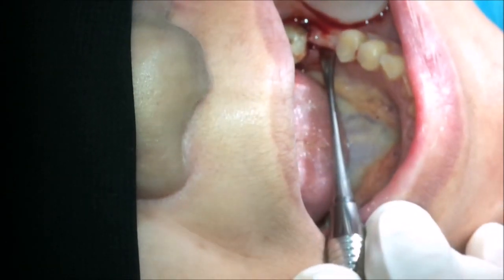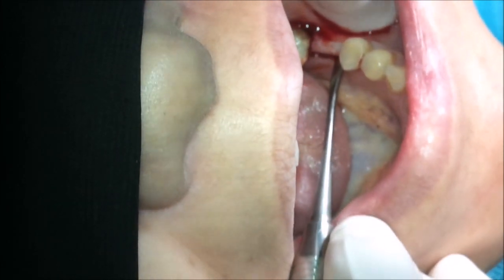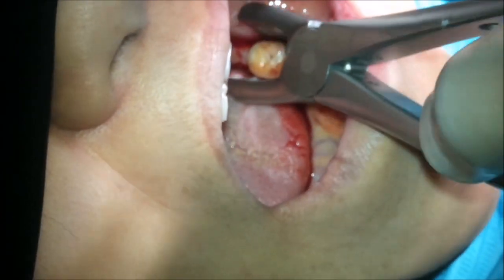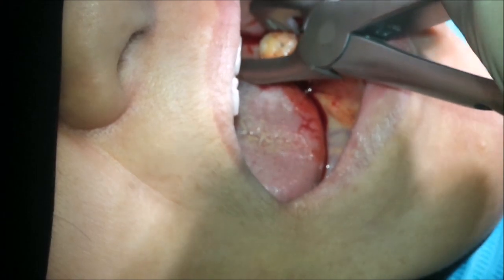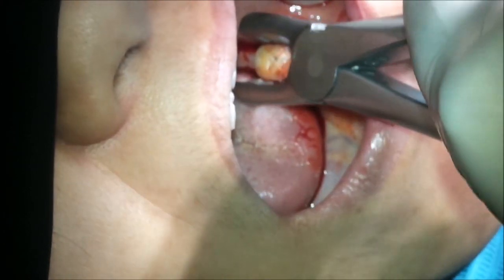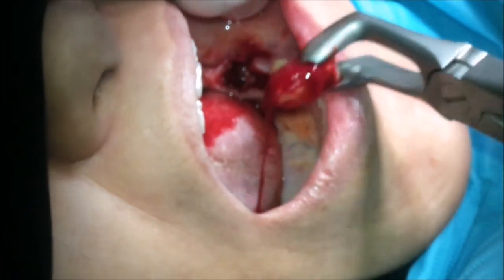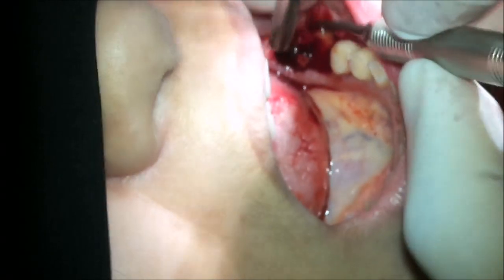Incision and reflection, and use any desirable forceps according to what is convenient for you for the extraction. After the extraction, we should make proper bony curettage to remove the granulation tissue.